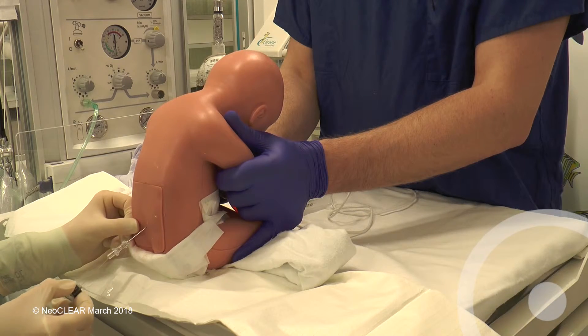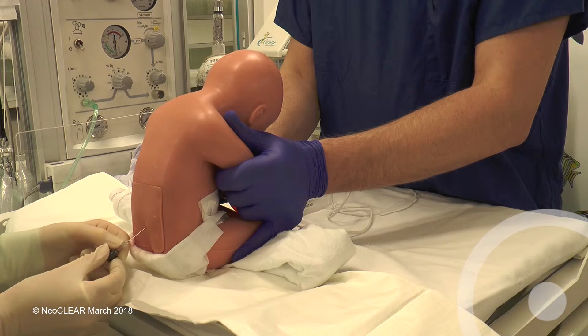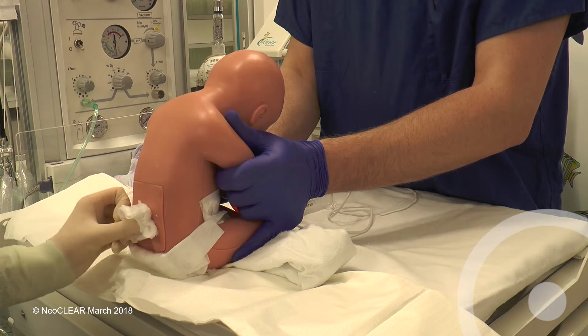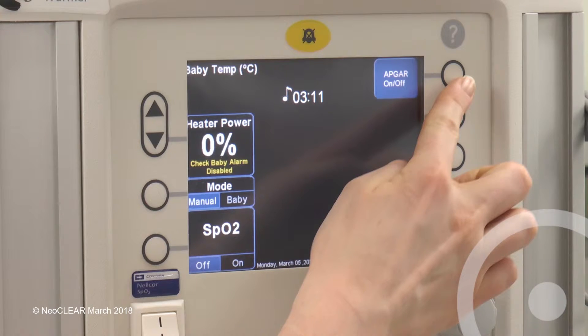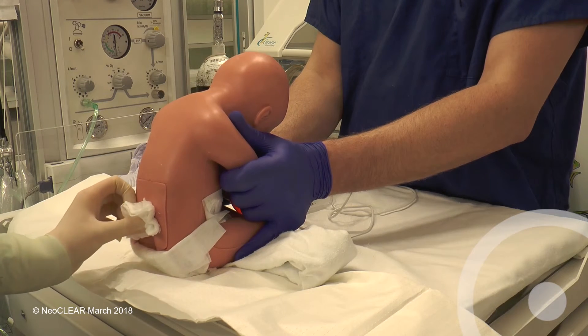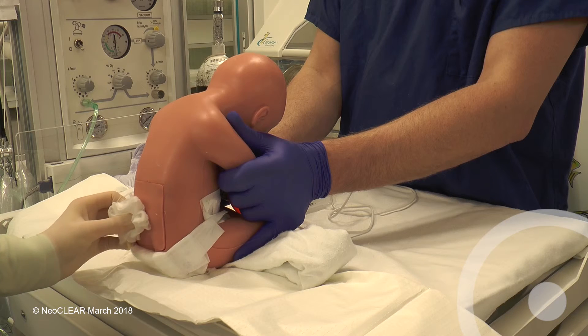Replace the stylet, remove the needle and apply sterile gauze. Note the time of the end of the procedure once the needle is withdrawn if the first attempt has been successful, or continue timing until the end of the second attempt if required.